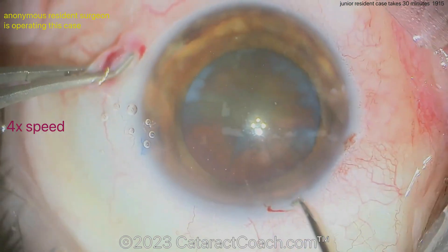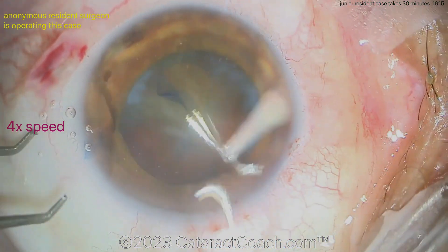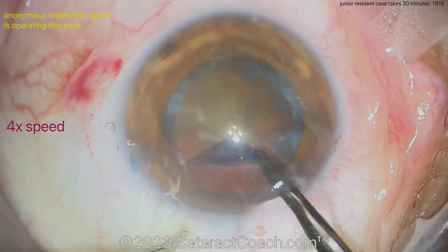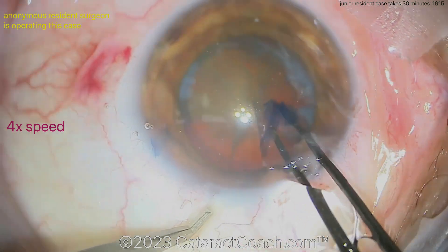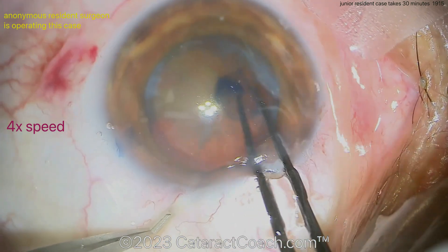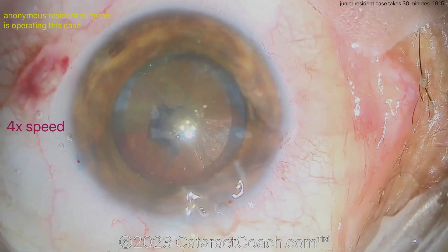The main incision looks pretty reasonable. Now fixating the eye with forceps while starting the rhexis with the cystotome, then going back in with the forceps. You do need to upgrade and stop grabbing the conjunctiva — you can see that subconjunctival hemorrhage. I know it's only a cosmetic issue, but that's one of the next steps to fix. The rhexis looks good — nice technique holding the forceps appropriately. Good attempt floating inside the incision, and a nice good-size five millimeter rhexis.